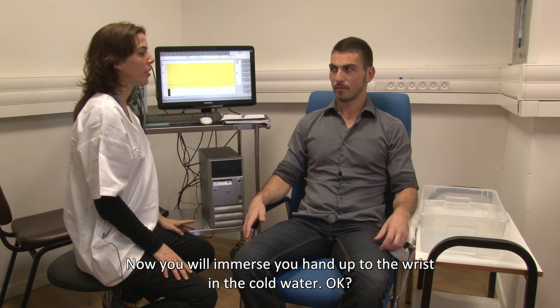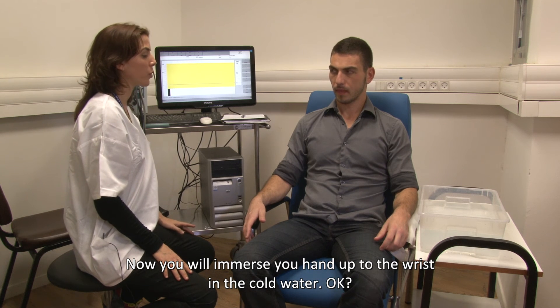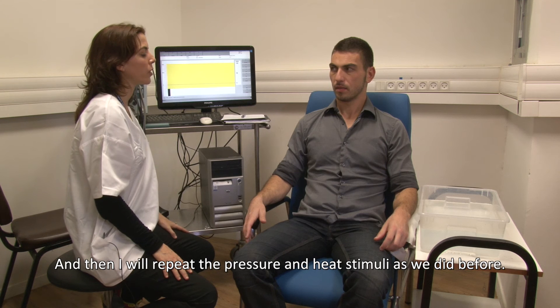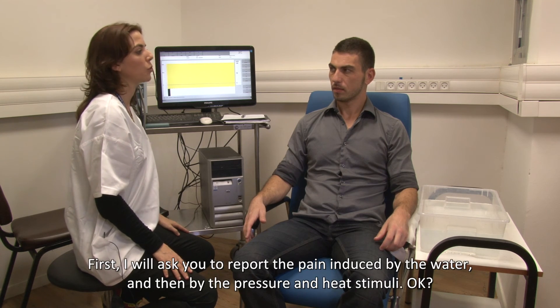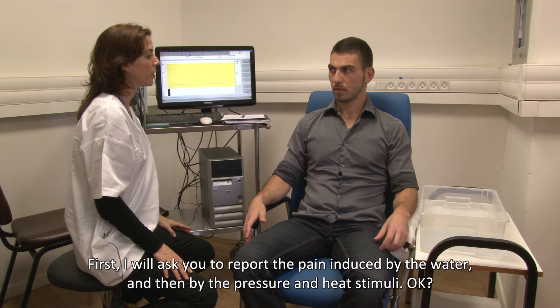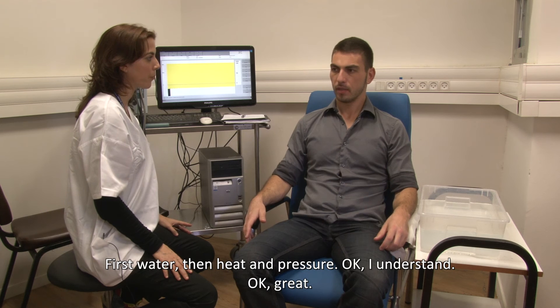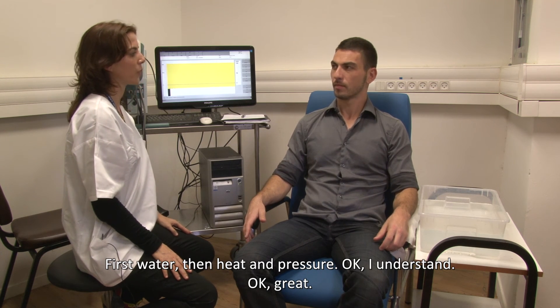Now you will immerse your hand up to the wrist in the cold water, and then I will repeat the pressure and heat stimuli as we did before. First, I will ask you to report the pain induced by the water, and then by the pressure and heat stimuli. First water, then heat and pressure.